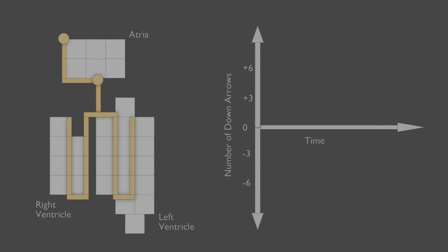One other thing, our graph is only going to count up and down. If we see any side-to-side movement, we don't count it. This isn't just hand waving. This is an actual phenomenon in the real world. Any energy that is perpendicular to our lead is going to be invisible to us from that lead. And again, we'll go a lot more in depth about that in the future. But for right now, we've got a pretty simple model.